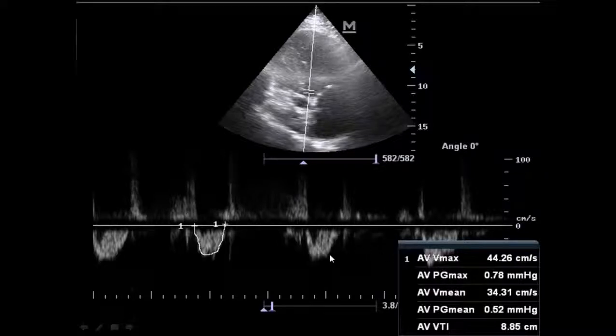So for the patient with hypovolemia, and for our patient, you can give boluses of fluid. You can give repeated boluses of IV fluids as long as VTI is increasing by 12% from this value. That means your patient is fluid responsive, and you can keep going until VTI is not increasing by 12%. You can stop here. This is controlled targeted IV fluids. Let us see.